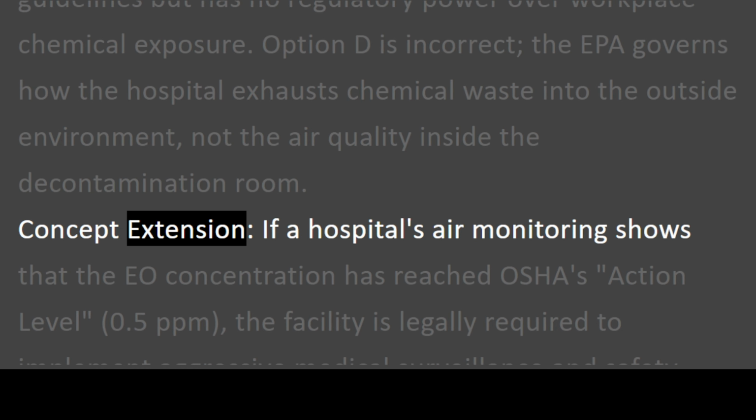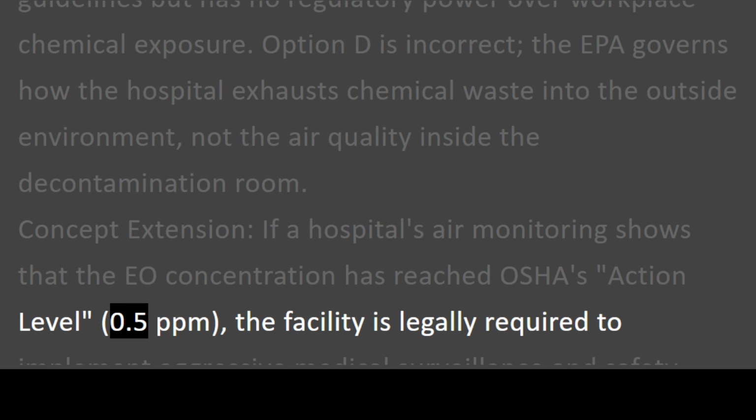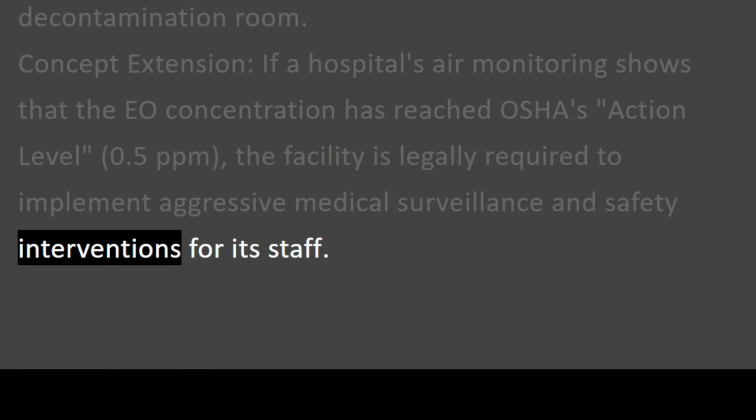Concept extension. If a hospital's air monitoring shows that the EO concentration has reached OSHA's action level, 0.5 ppm, the facility is legally required to implement aggressive medical surveillance and safety interventions for its staff.